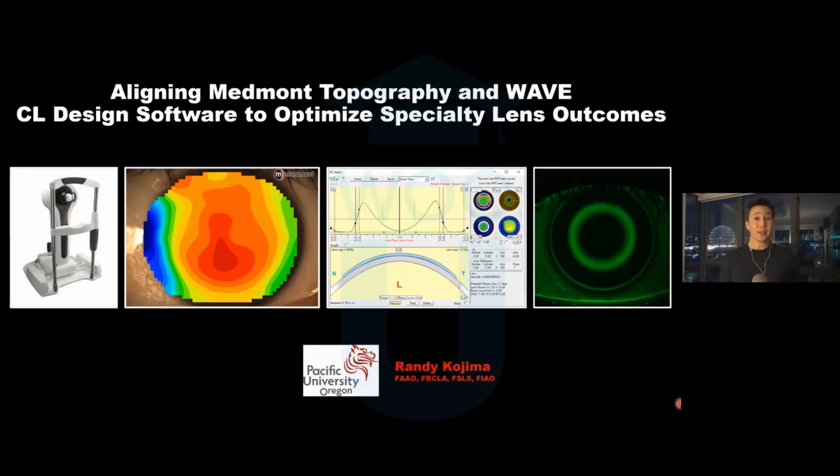I'm so excited to be able to have this session with you and to talk a little bit about how we align Medmont and this super powerful software called Wave. I know most in the group will already use it, but there may be some newbies or neophytes. So we're excited today to give you that connection between the two. How do we use Medmont to best support the Wave software?